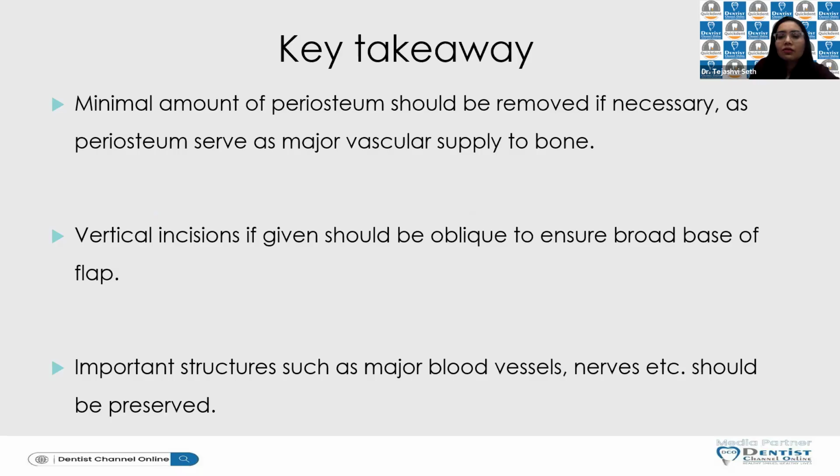So to summarize and to give you a takeaway from my session, if possible, keep your periosteum intact. It should not be removed unnecessarily. Periosteum is very, very helpful when you want proper wound healing, when you don't want the blood supply to your bone to be severed.